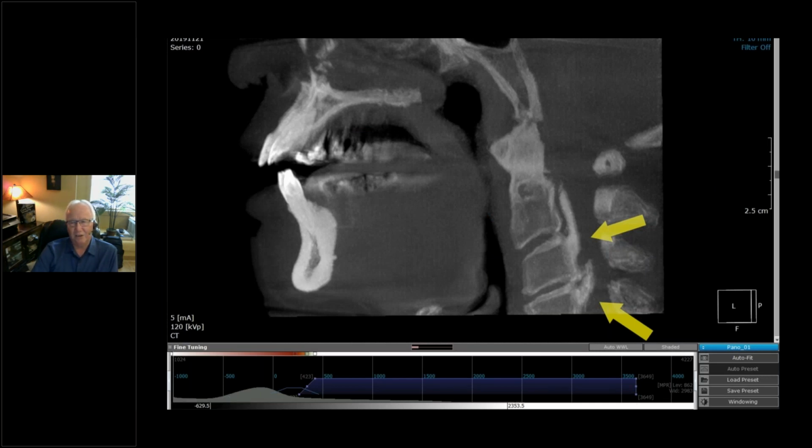Here's one of those things that I just threw in at the very end. You're going to see odd things sometimes. No one in this audience probably knows what they're looking at. My pathologist friend and colleague, Bob Danforth, calls these chicken spurs. I don't know why pathologists name everything after food anyway. But this is actually calcification of the longitudinal posterior paraspinal ligaments.